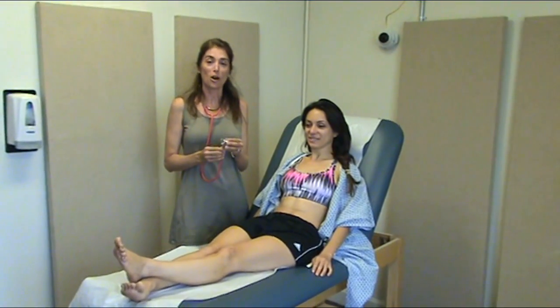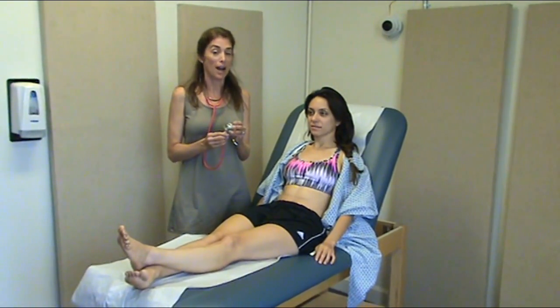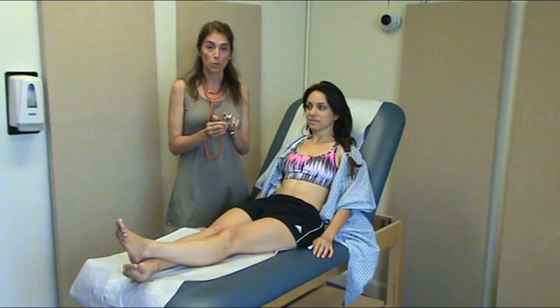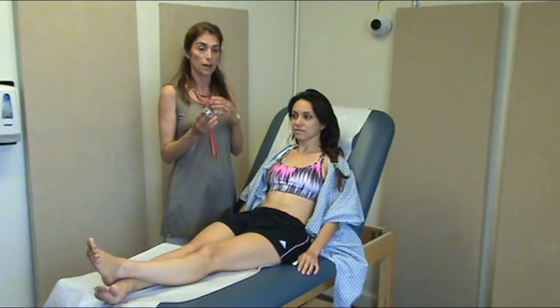When you're listening for heart murmurs, you're going to listen with both the diaphragm and the bell of the stethoscope. When listening for high-pitched murmurs, you're going to use the diaphragm, and when you're listening for low-pitched murmurs, you're going to use the bell. So you're going to go through each valve listening with both the diaphragm and the bell.